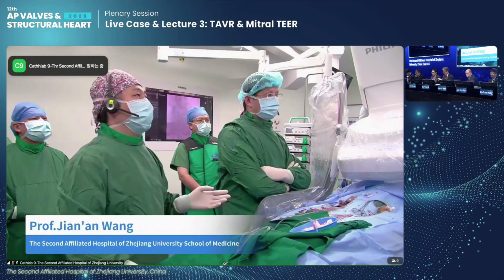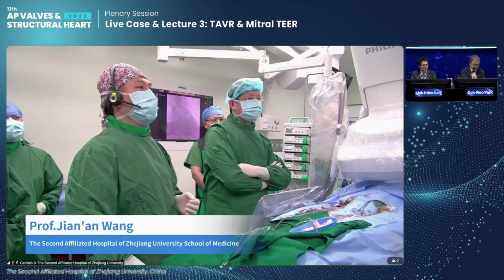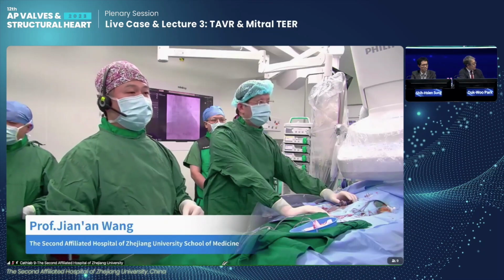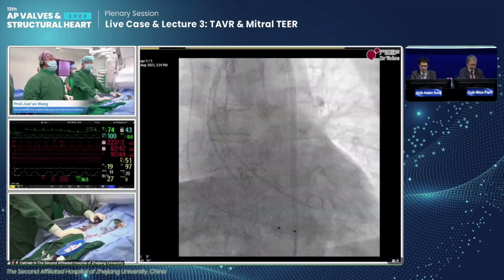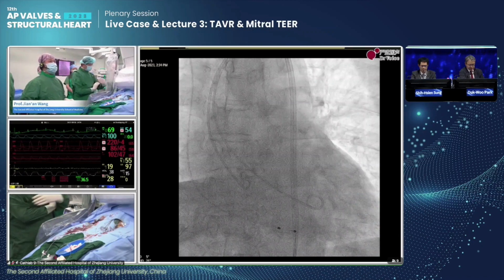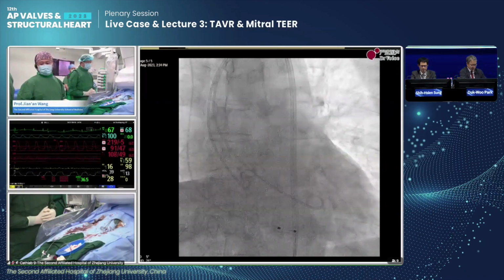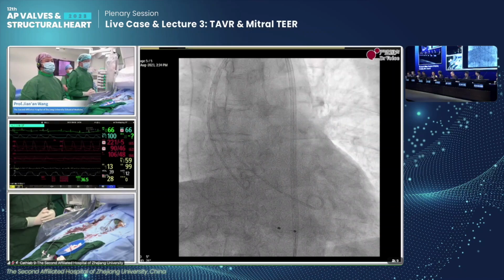Okay, that's all. Thank you for the nice introduction, and we have invited world-renowned panelists. If I summarize this patient, he is a 75 year old male, with an intermediate STS score of 6.5 to 7, and the perimeter derived diameter is 25. So bicuspid type 1 with heavy calcification, and Professor Wang is going to use the self-expandable Venus A+. Any question or comment from panelists for this patient?